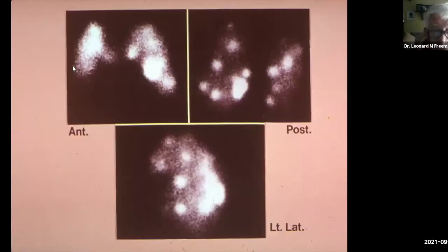Sometimes you get what we call radioactive pulmonary emboli. These are large particles. This usually happens if you inject a patient and after you've drawn the blood back into the syringe, you actually lose the vessel. So what happens is you have to find a new vessel. In the meantime, the blood that has been drawn back into the syringe with the macroaggregated albumin coagulates and causes larger particles.